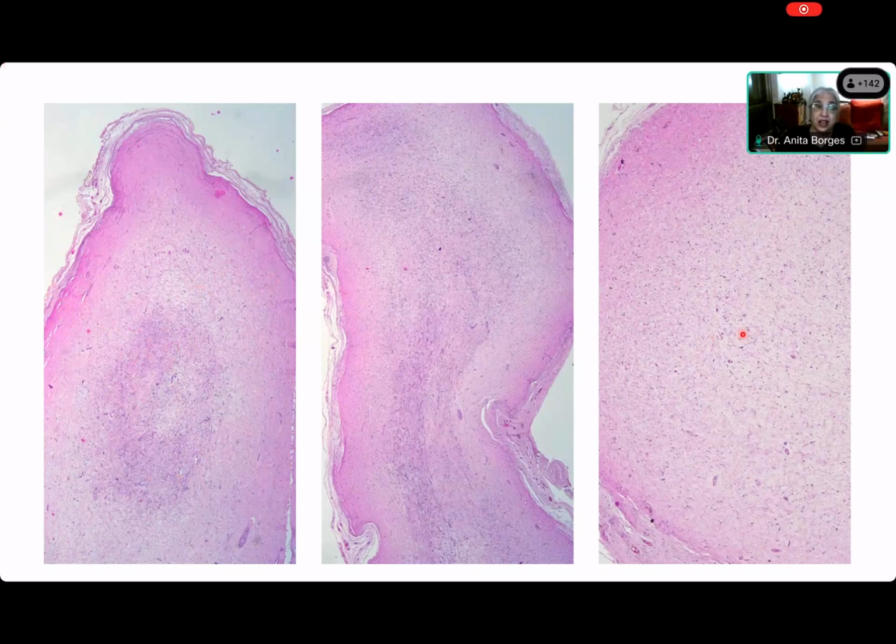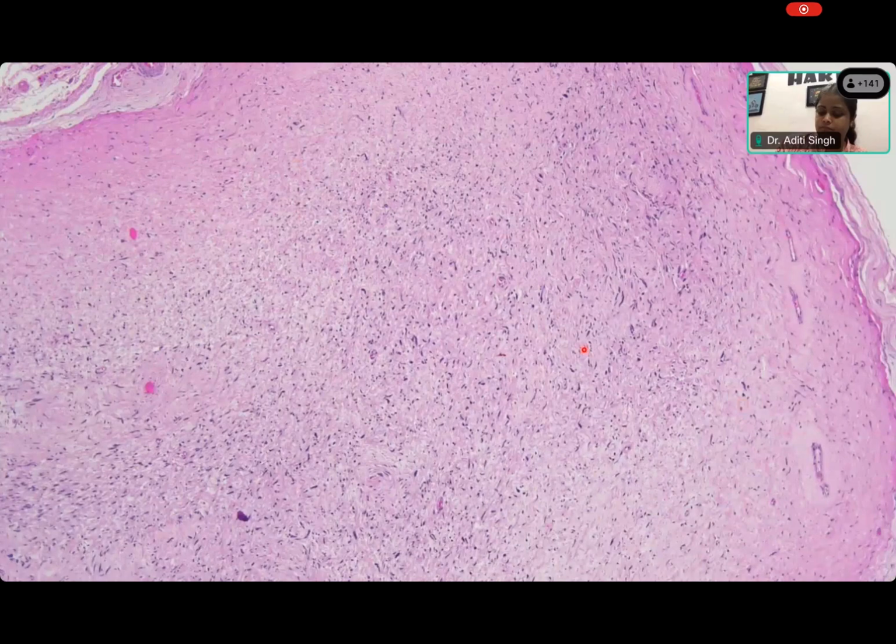And it's very unevenly cellular as well. Look at the cellularity on the right hand side. Very, very almost acellular in some of this. Now we can go to the periphery. You see the collagen of the periphery, all right? And then you come towards the center. It becomes, yes, there is collagen, but it's becoming also more myxoid. There you are. Okay. So now come on, describe this.